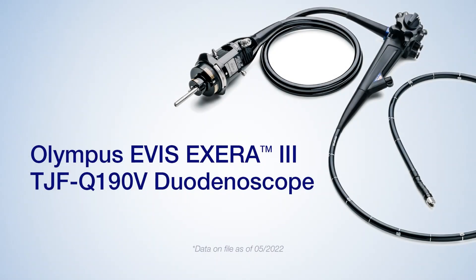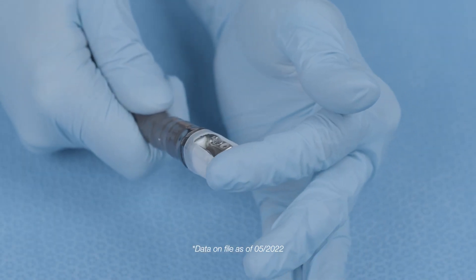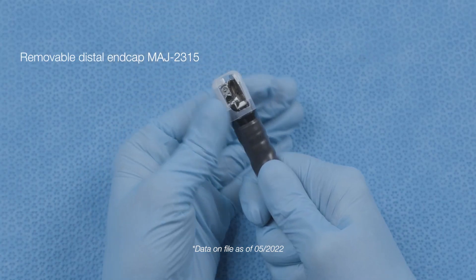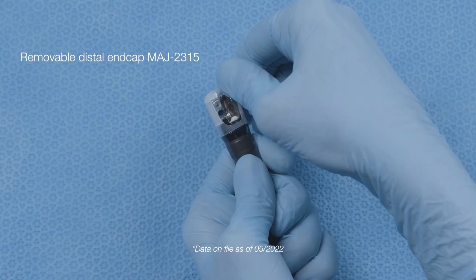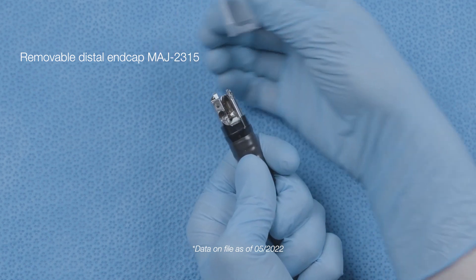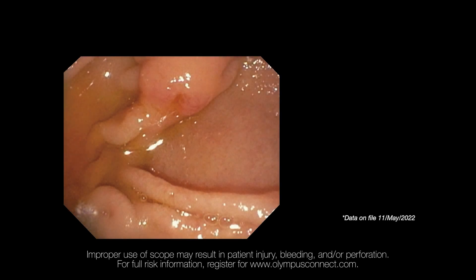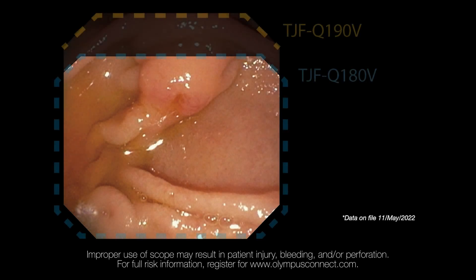The Olympus TJF-Q190V duodenoscope improves upon previous reprocessing techniques with an efficient design that provides easy access for brushing and flushing. The single-use distal cover is designed for easy setup and improved visualization of the distal end, which in turn provides access for manual cleaning and reprocessing.